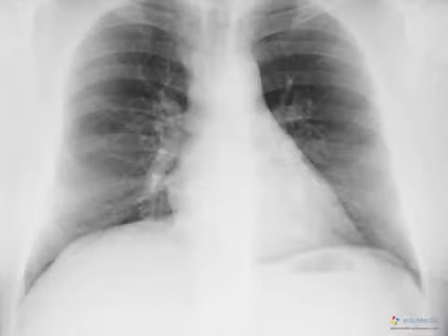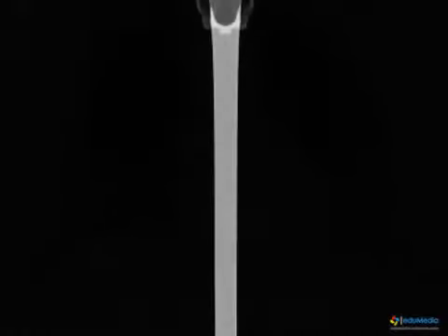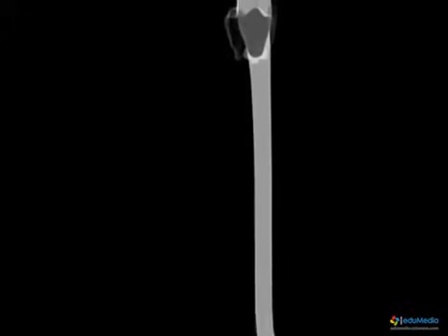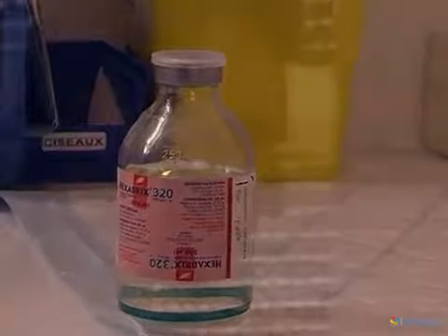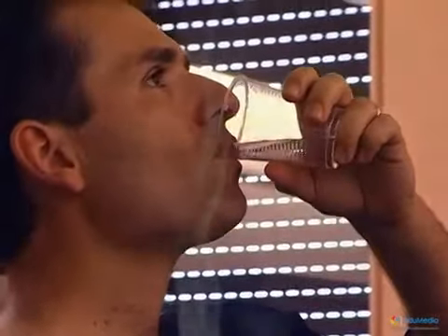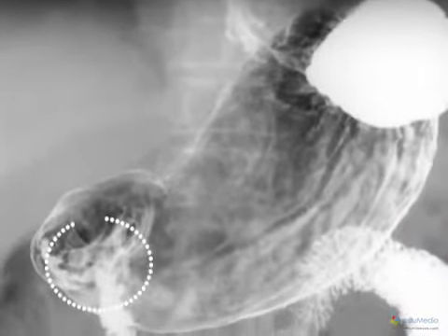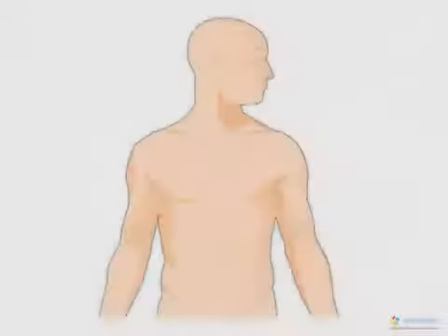Contrast medium is sometimes administered to enhance the contrast of some structures that wouldn't be seen without. This is the case for the esophagus, which gets mixed up with the other organs. For that, patients are required to drink a mixture of barium sulfate and water. Because it blocks the passage of X-rays, barium-filled organs stand out better on the final images, and the photos show successively the esophagus, then the stomach, then the duodenum. This examination is called an upper gastrointestinal tract radiography, or upper GI for short.